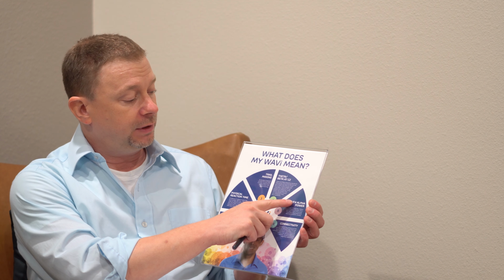So the ratio of F3 to F4 should be roughly equal. There's a little bit of a difference. It doesn't have to be exactly equal, but if it was heavily weighted more left side, that might give us a lot more left output and a lot less right, and that would set us up for an imbalance of the brain. Likewise, if it was low F3 and high F4 output, that'd be high output in the right hemisphere and the right frontal lobe, and that would also be an out of balance thing.